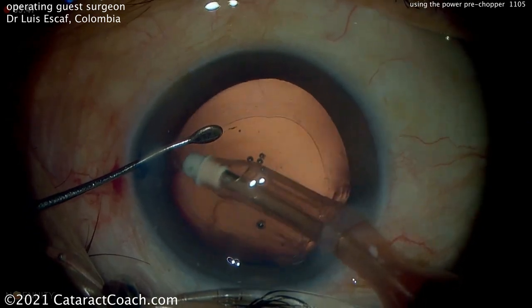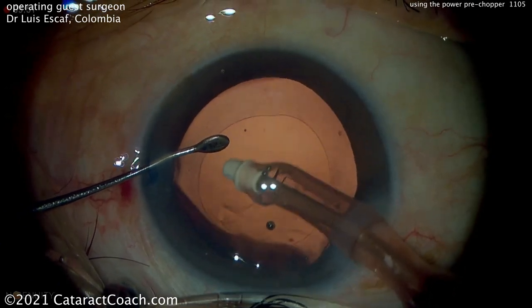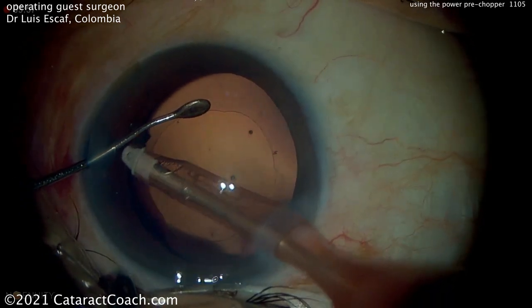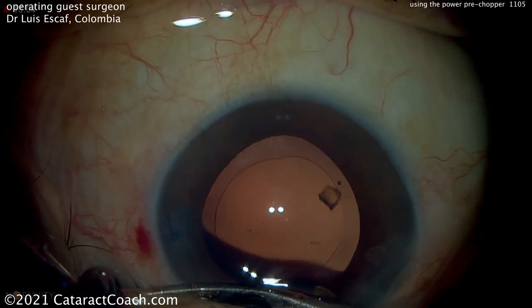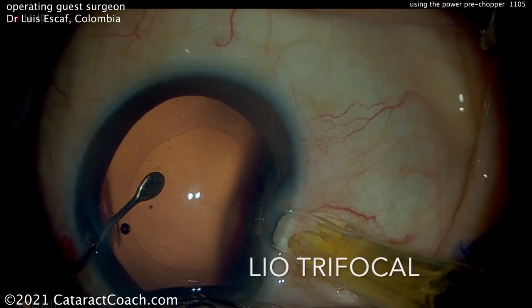And so this heads-up display — we've also tried it at our own center. It tends to be a little bit bulky for normal everyday use, and for a five or ten minute cataract surgery, we don't find it super useful. But with newer technologies, it's important to try all of them. And maybe in the future we will have other more advanced technologies on here that may make it useful.